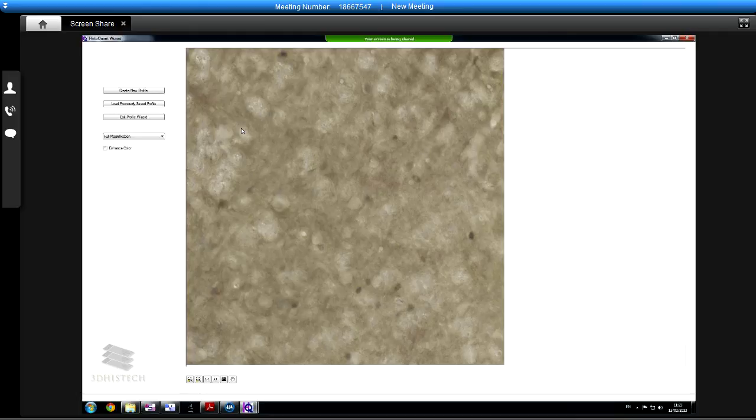And the first stage is the option to apply one of these filters. What this does, if you can imagine when we're trying to count, in your case, nuclei here, this looks pretty round to us, but to the computer, if you zoomed in a bit more, you would see that it's got uneven edges and pixels, especially if it's out of focus or depending on how small it is compared to the resolution of the system. So what is quite useful sometimes when counting, particularly things like nuclei or other round features, is just to smooth it all out a bit.